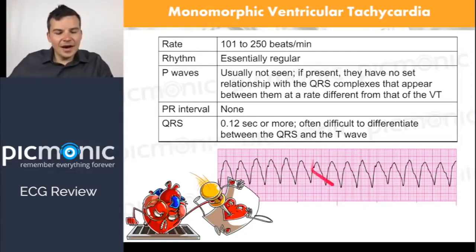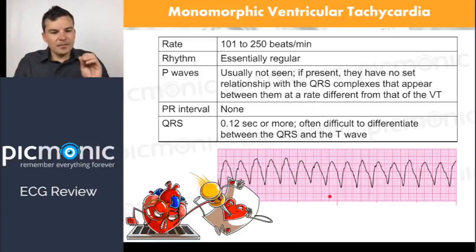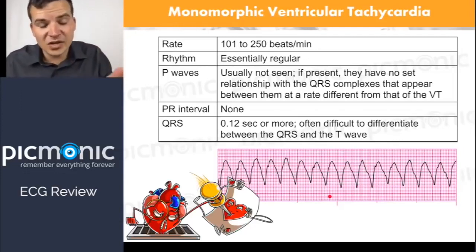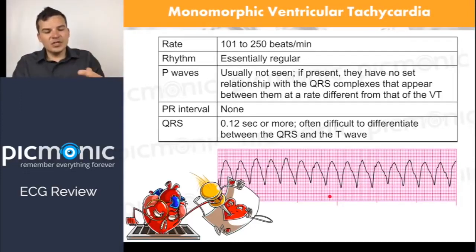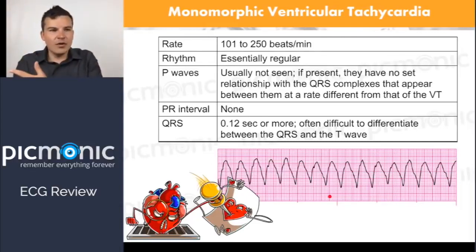The important thing is that you've got to check for that pulse. Because this is just a trick question that always pops up on ACLS algorithms, a big one for paramedic, nursing, and medical school. What's the first thing you do? Check the patient. One, because it's easy to look like they have VTAC on the monitor if the patient is moving. Number two, pulseless VTAC is treated differently versus VTAC with a pulse.